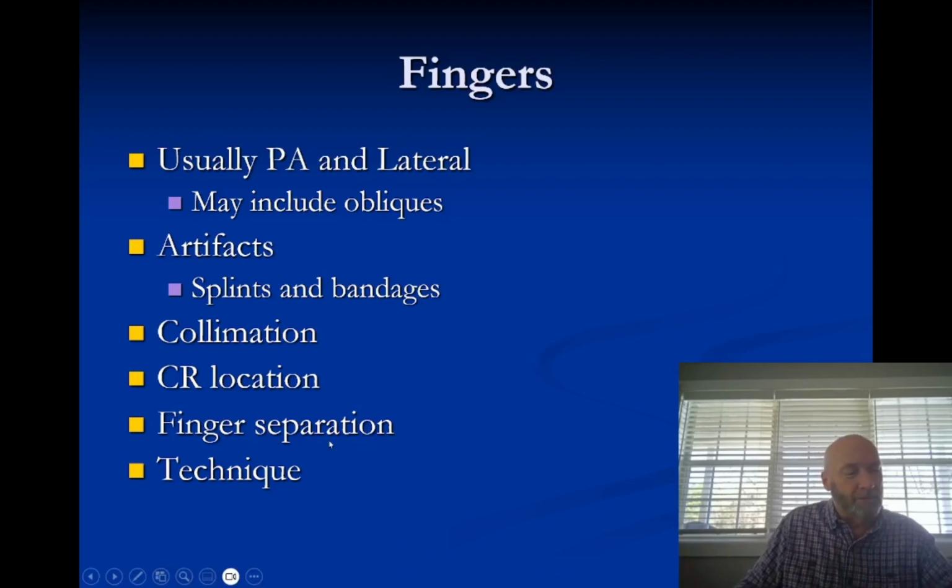So those are suggested. There's obviously a great difference between 55 kVp at one mAs and 65 kVp at one mAs, so make sure that you pay attention to your index numbers. If you are a student who's struggling with technique, that's probably the hardest thing to teach, in part because you're going to base your understanding of technique on what you consider to be a small, medium, and large patient.